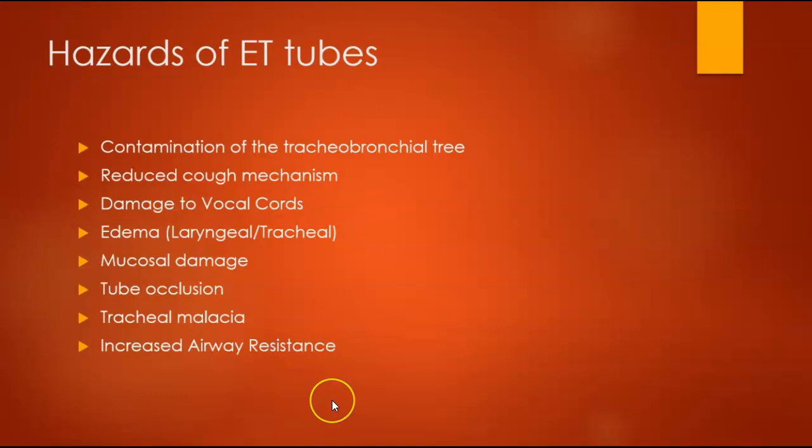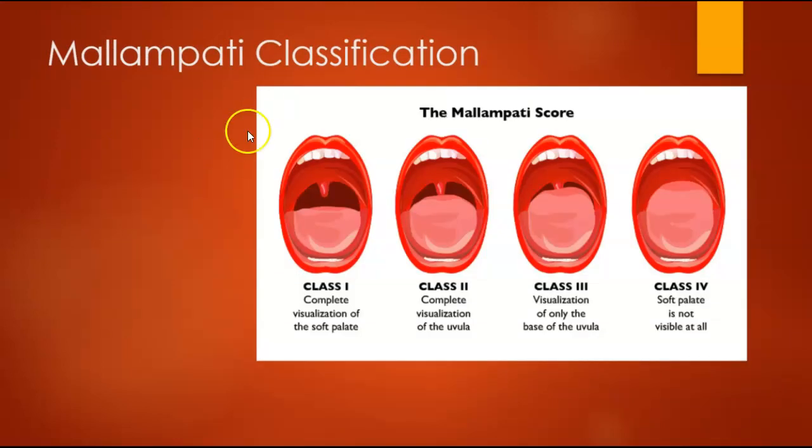So if I notice that I have a patient whose airway resistance is continuously increasing while they're on the mechanical ventilator and they've been intubated for a while, I might look at doing a tube exchange to see if it's because of excessive amounts of secretions in the airway.